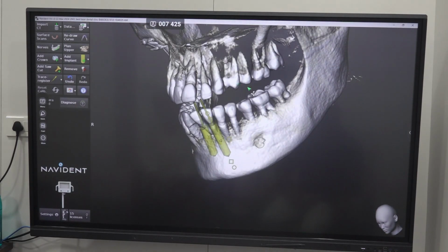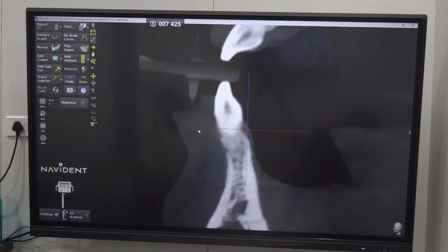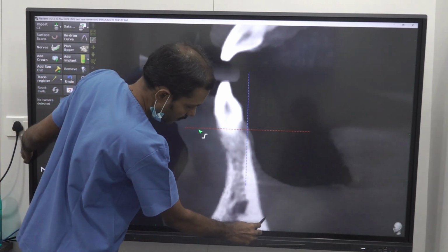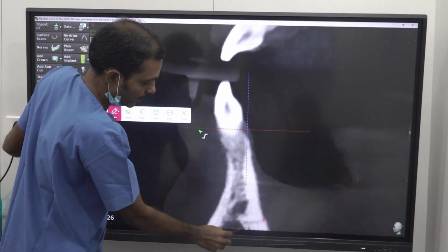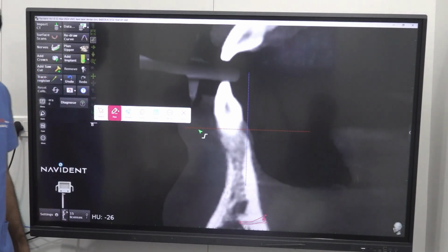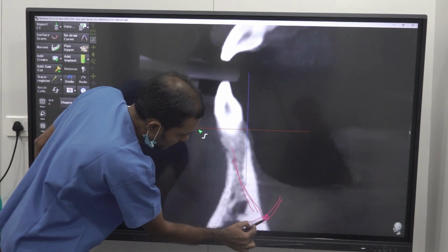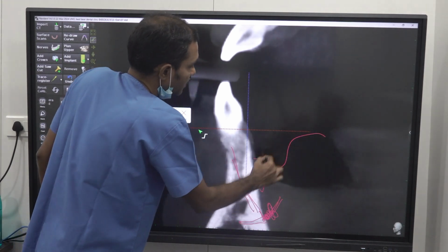And one more important thing is the mandibular midline. Okay, so this is the midline. You can see the lingual foramen here. The lingual vessel is coming inside. So during drilling, if you perforate outside and if you perforate this lingual vessel which is entering here, you will see the hematoma here. The tongue will bulge.